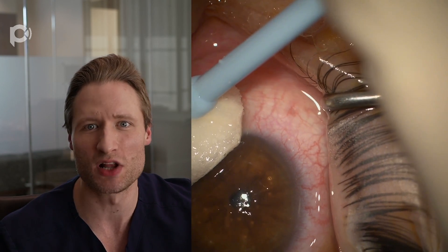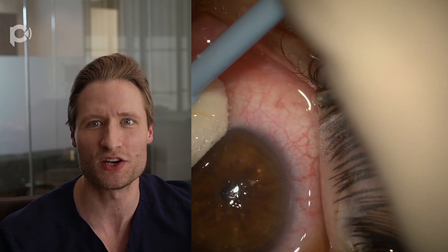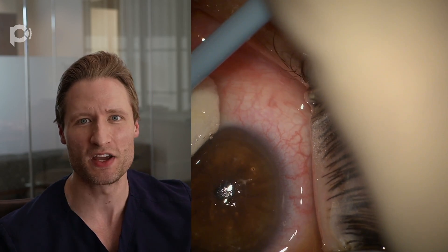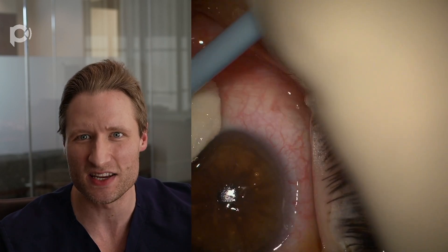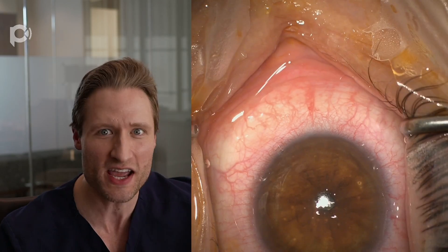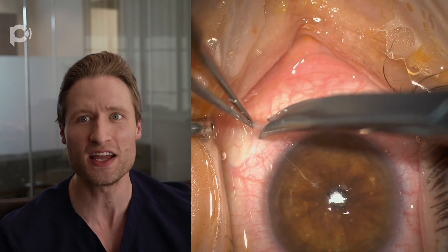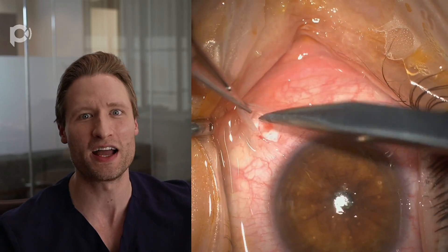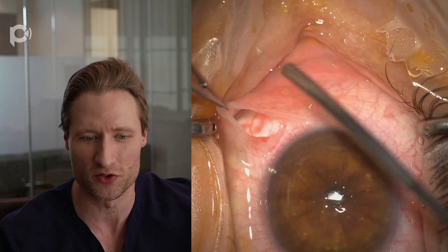Once we have the subtenons block administered, I'll show you how we're going to line up implantation of the segment, make all of the incisions, and put the segment in. The key, which you'll observe later on in the case, is we're going to use segments stained with Trypan Blue and dehydrated. Dehydrating these pieces of collagen by letting them dry thins them tremendously and makes them rigid, thereby making them extraordinarily easy to insinuate into a corneal channel.